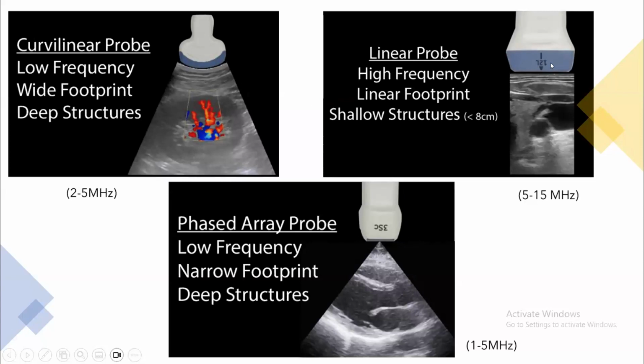And we have the linear probe, which is high frequency, linear footprint, shallow structure. And you can remember also that high frequency is high, so it can show the higher structure. The low frequency can show the lower structure.